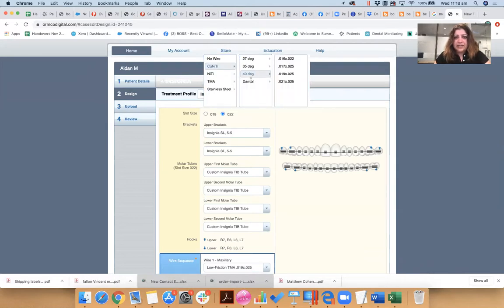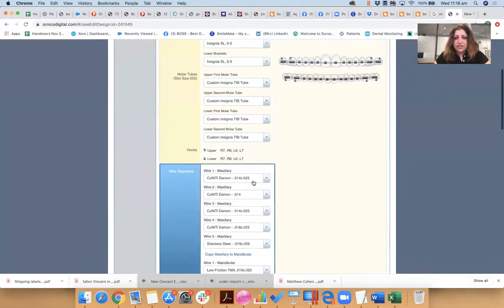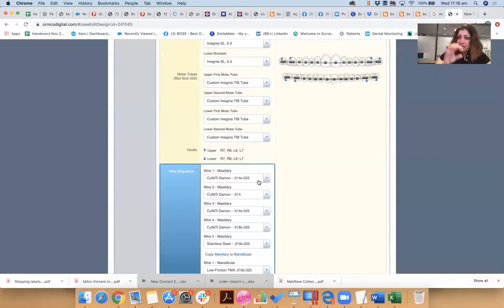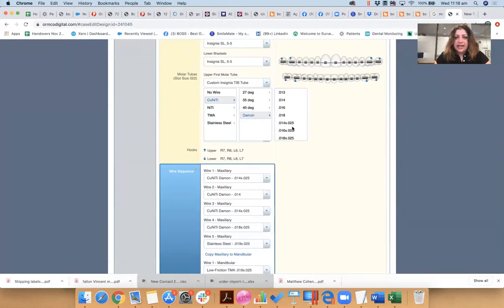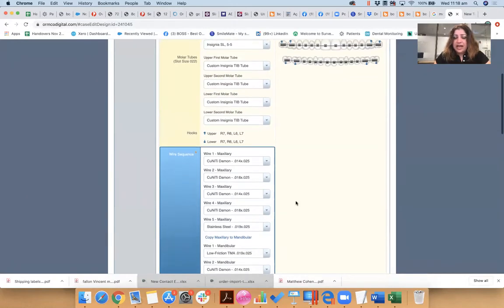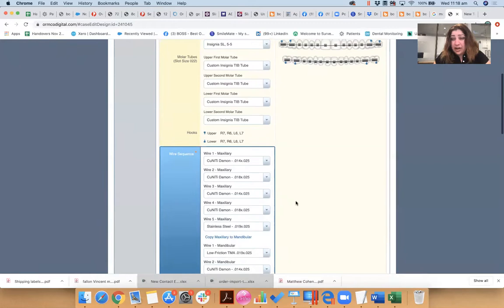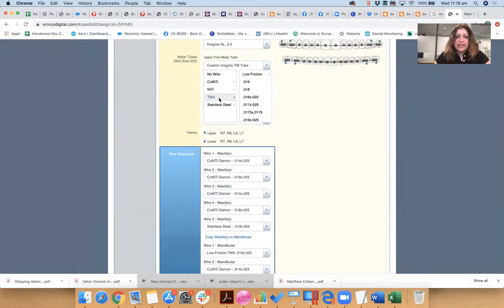So for example, let's see, my first one might be a copper NiTi. And I like my Damon shapes, so I'm going to go 14x25 NiTi. That'll be my first customized wire going into this patient's mouth. The next one, I might want to go up in sequence and I might like a 18x25.